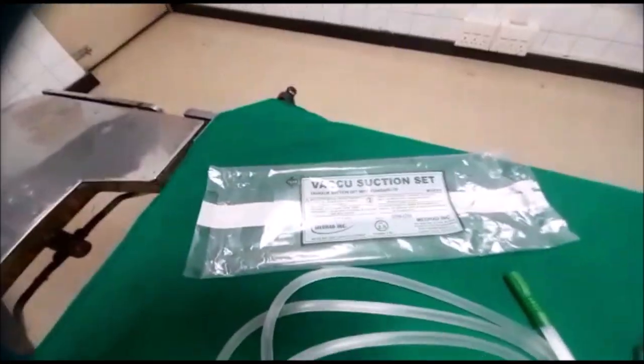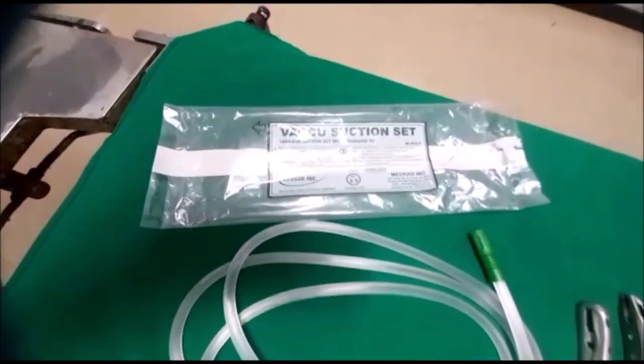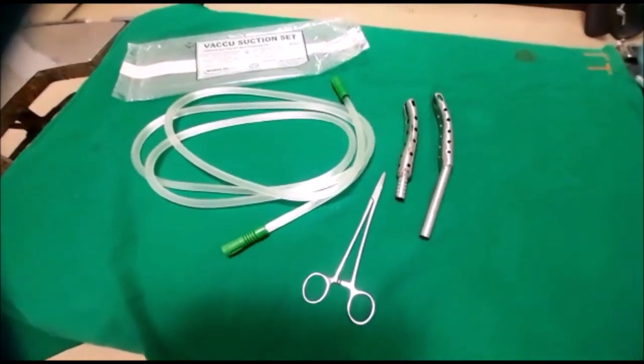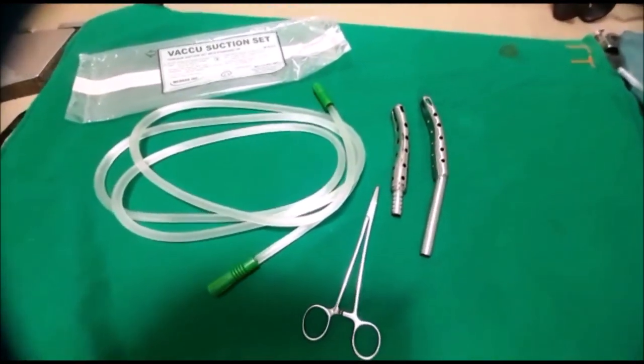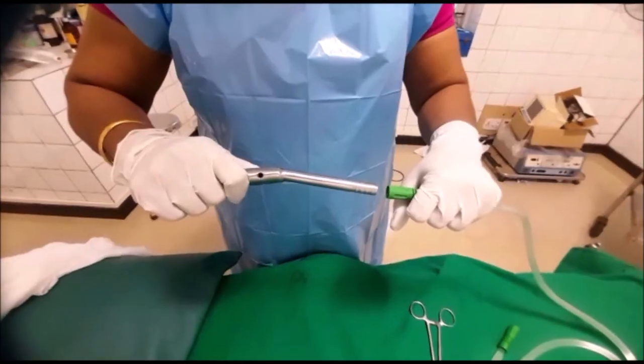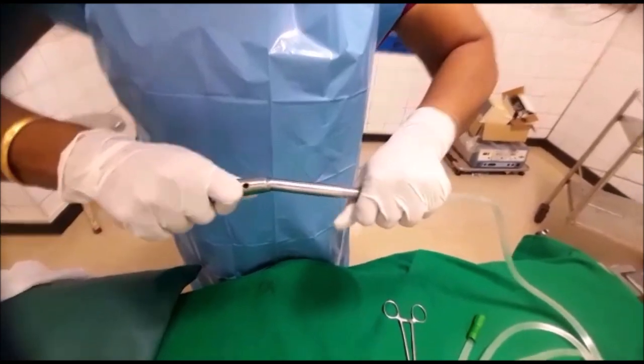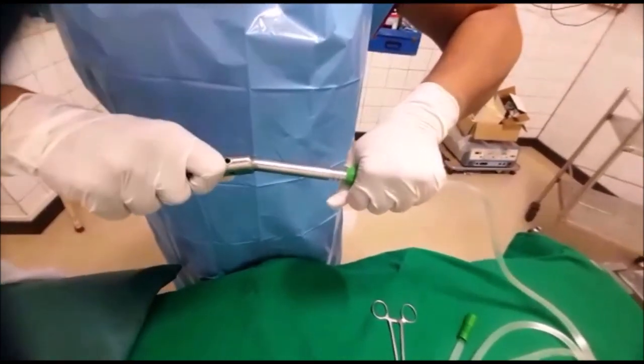This is the Ramson suction tube I am using. I will show you how to fix the suction tube to the cannula. See how I am fixing the cannula to the suction tube.